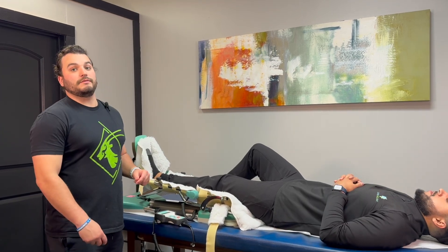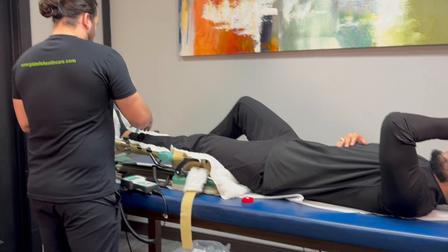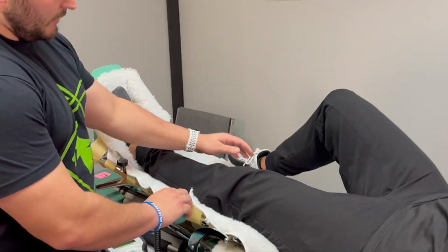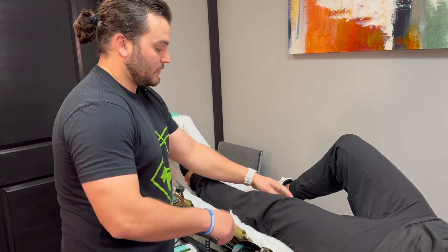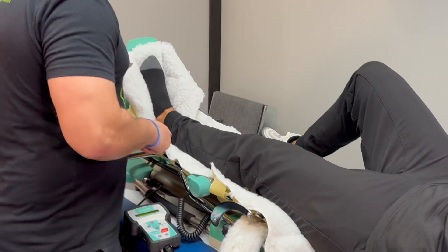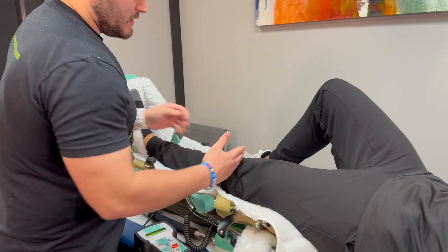Now I'm going to show you how the patient should be fitted on the CPM. Our patient Austin just got his total knee done. Whenever you are fitting a patient into this CPM device, the key factor is that his knee needs to be next to these hinges — this is where the brace bends, so that is where you need the knee. His knee is about two inches above the hinges, so we want to have him scoot a little bit more forward. By adjusting these dials, you can loosen up the CPM and extend it so Austin is nice and centered with the hinges.